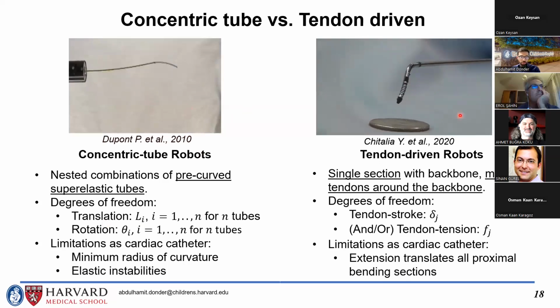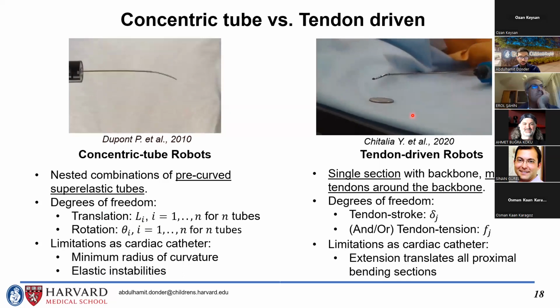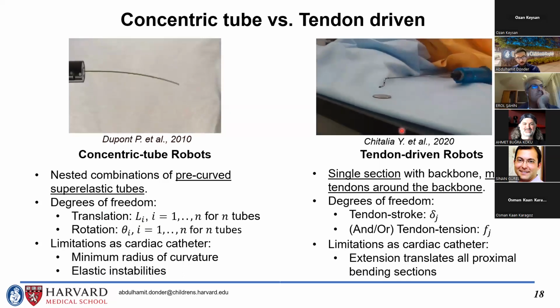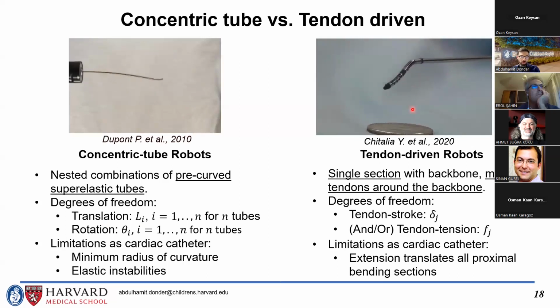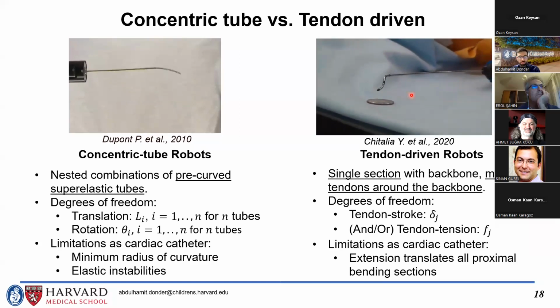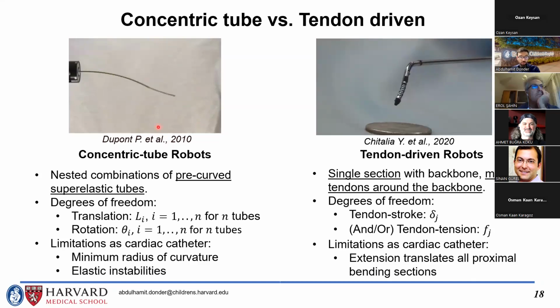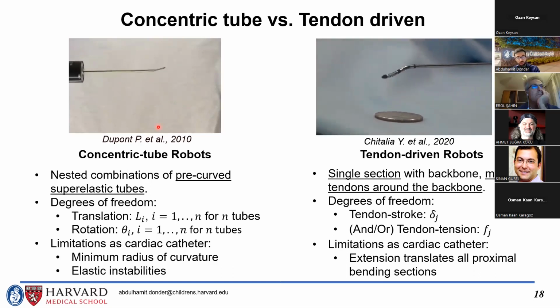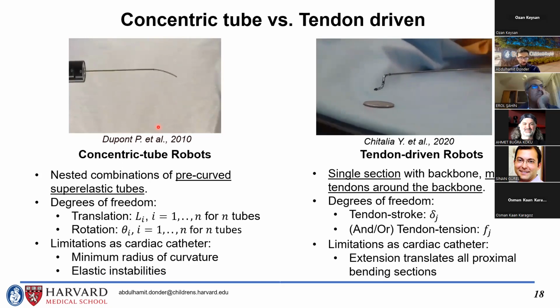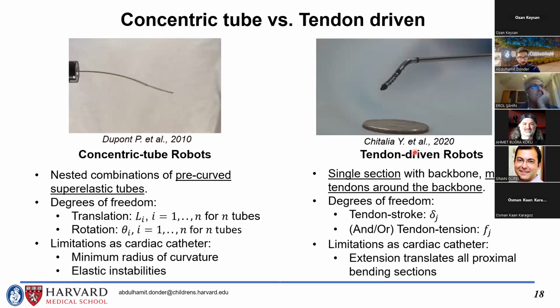Now, the other popular approach is tendon-driven serial continuum joints, like the 2-degree of freedom robot you see here. In these robots, one or more tendons are attached to the distal tips of each joint, and actuating these degrees of freedom can be achieved by tensioning the individual tendons. Each approach has its limitations. Concentric tube robots can have snapping instabilities where the tip of the robot can snap from one minimum energy state in its workspace to another, much like an unstable equilibrium of an inverted pendulum. While tendon-driven robots have a limited number of degrees of freedom.